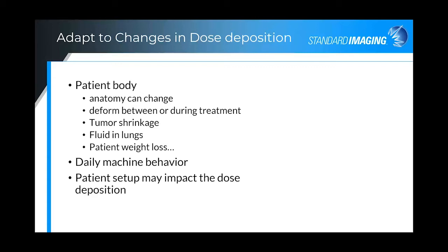All of these aspects must be considered relative to the cumulative dose over the course of the treatment. For example, one of the cases I have is an example of whether a one-day or multi-day alignment issue will require adjustment to meet the prescription dose.